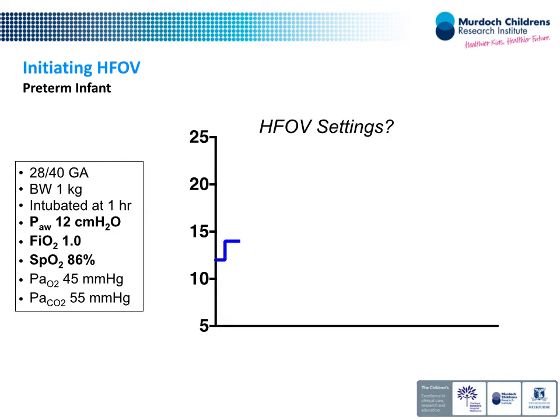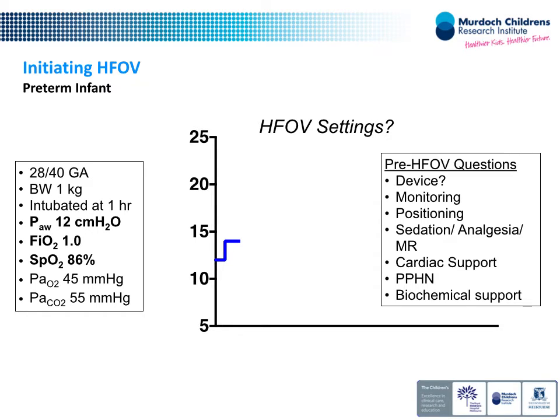I'll come back to that in a minute, because in this sort of disease, I would advocate you don't want to start... Yeah, but essentially this is at the period of time where you could have been in a first intention trial too. You could argue this is almost first intention. So anyway, the good thing is you've all raised various issues about what to do before you even pick a mean airway pressure, so that's really nice, so thank you for doing that.